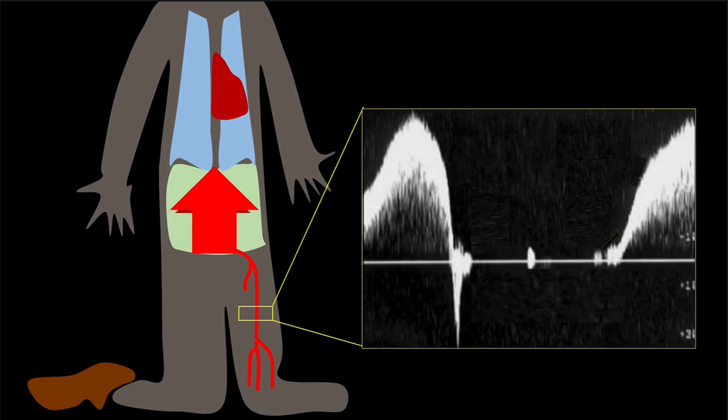Now, another thing that could be asked or shown is the Valsalva maneuver. So you're straining, and you really are increasing pressure here, and you increase it so much that you actually, you poop your pants, right? And then that leads to an actual reversal of flow.